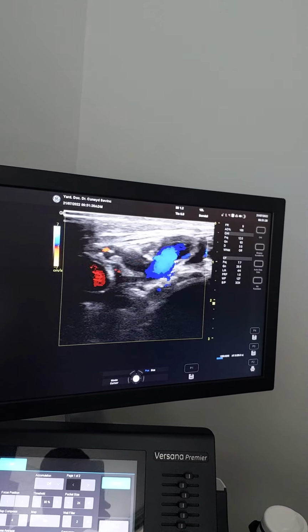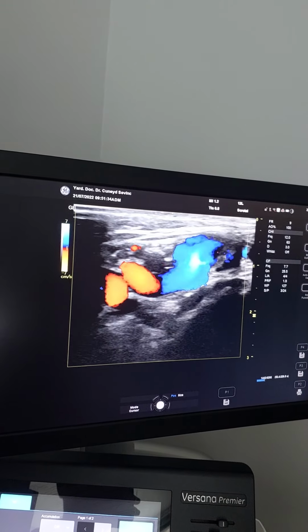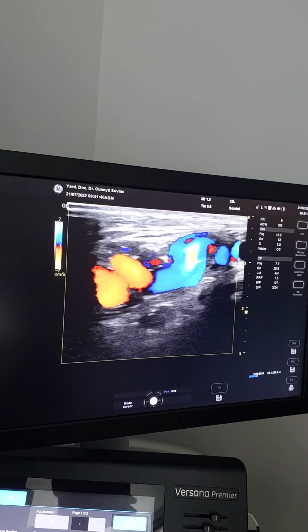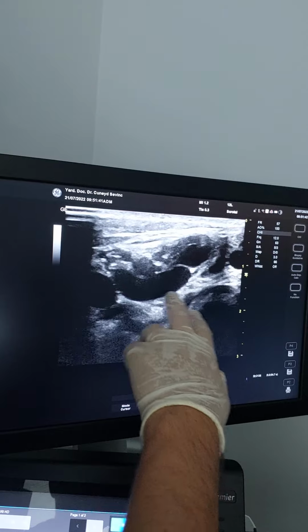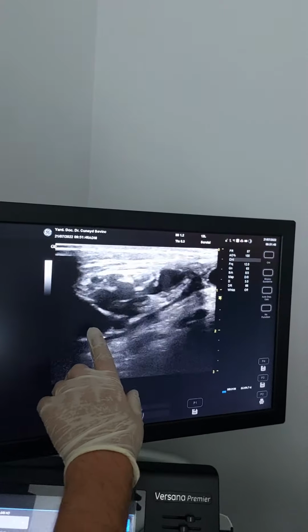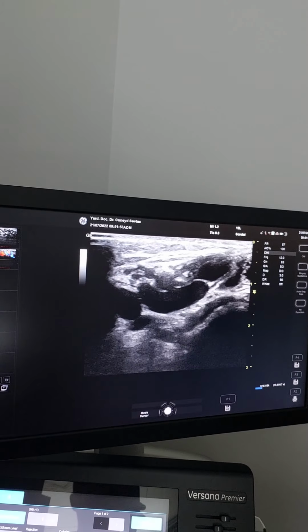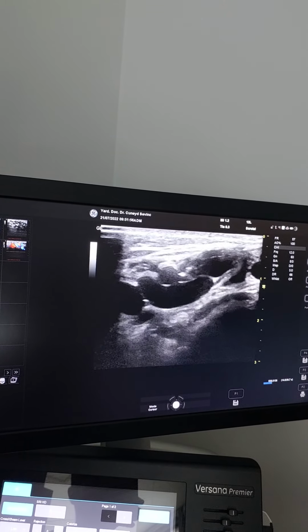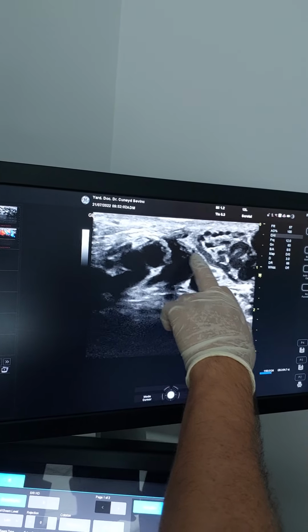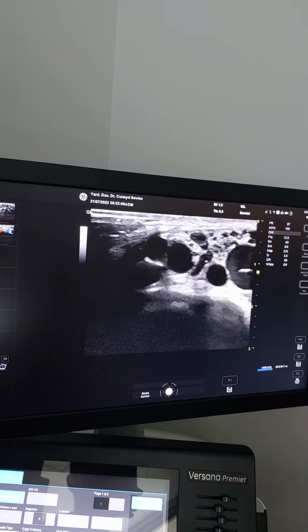So we are very experienced in these techniques, and I use the Doppler device before the operation, after the operation, inside the operation, another microvascular Doppler, and we take out these veins completely. Just inside the operation, we finish this. In classic operations, they just ligate these veins, and it takes too much time for these veins to disappear. And sometimes they never disappear. So we will take this vein out and look for the other thinner veins and maybe ligate some of them, take out some of them if possible.